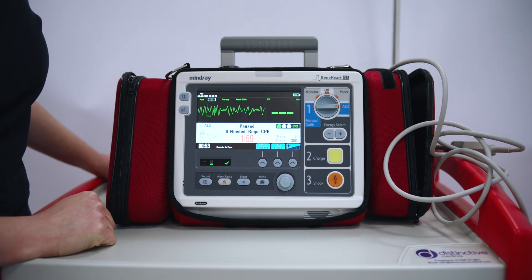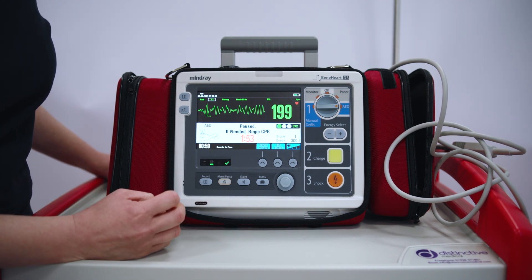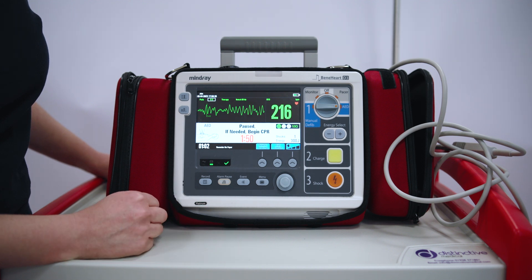SHOCK DELIVERED. PAUSED. If needed, begin CPR. We then follow the machine and do what it says.